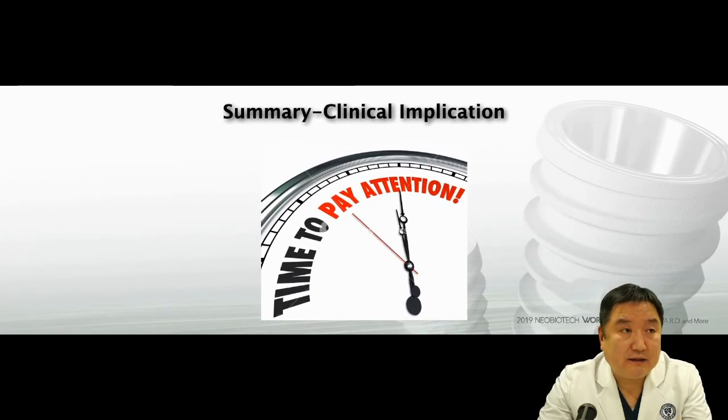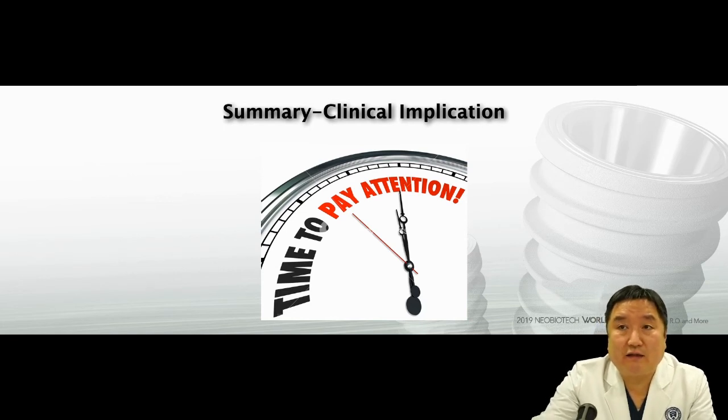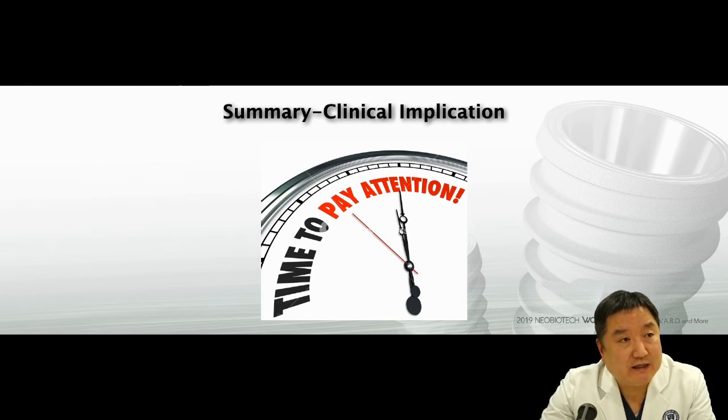And the second thing is, I'd like to say another important aspect of this study is the clinical implication. I'd like to say it is time to pay attention. In fact, there was no regulation or exploration of manufacturers because we didn't know this implant surface would age as time goes by.